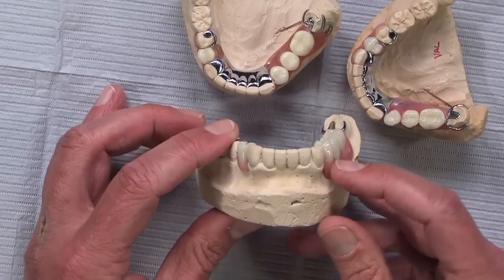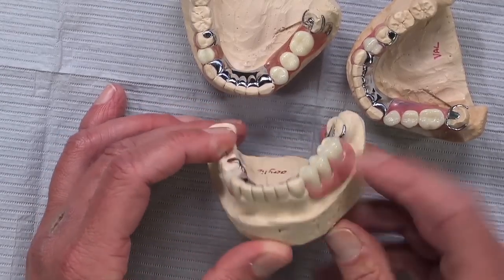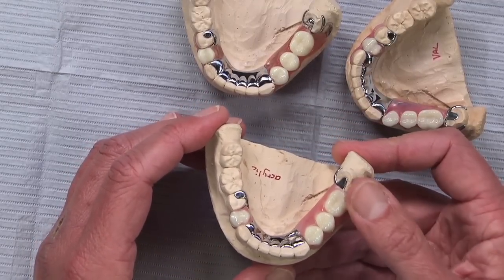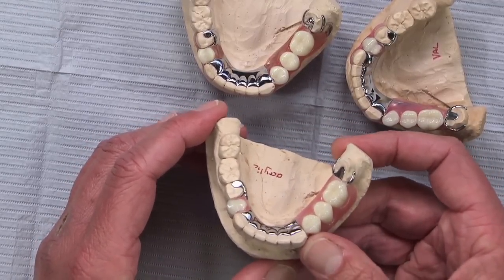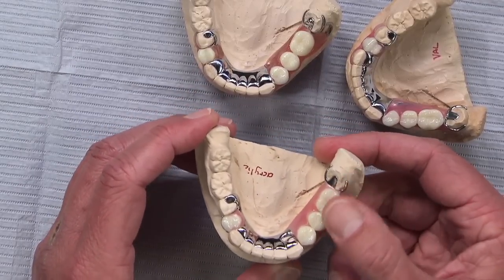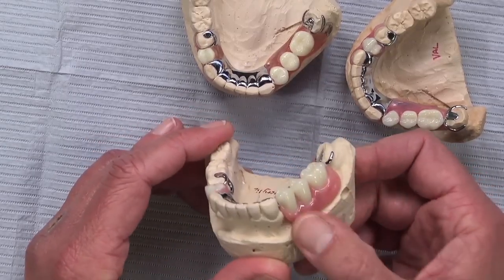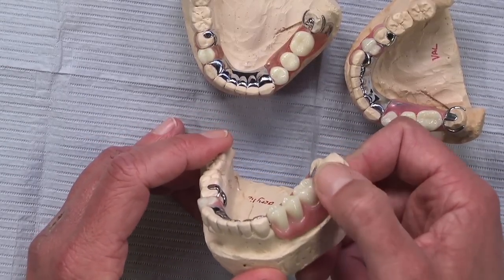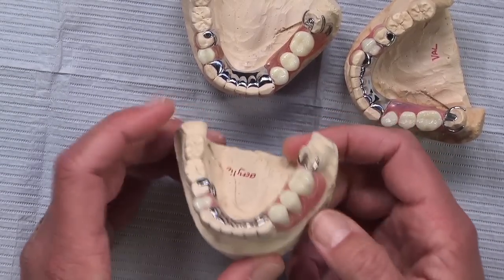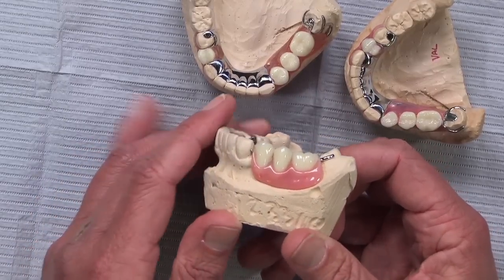Now, the one warning about this type of clasp, anytime you're engaging a distal undercut like this, it's really only going to work well on a tooth-borne partial like this one. That type of design, engaging the distal of a cuspid, for example, is not going to work on a free-end partial. We need to have this vertical stop here for this type of retention to work. If we're biting down and this tooth is missing, this is simply going to rotate back if we don't have that stop. So there are limitations to when we can do those aesthetic metal clasps.